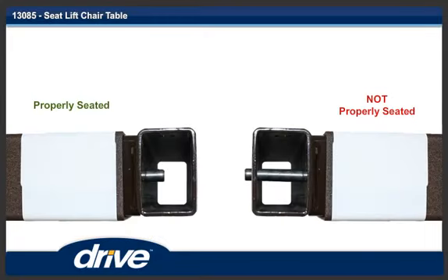Step 2. Make sure the trip rod in the column is fully inserted into the column. If it is not, shake the column until the trip rod is properly seated.